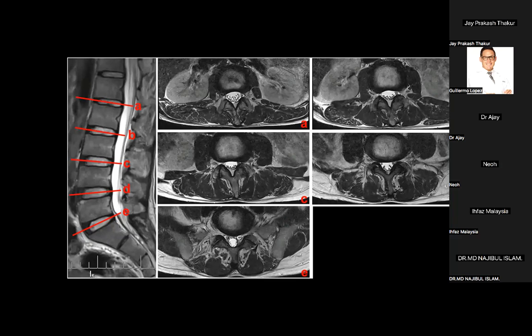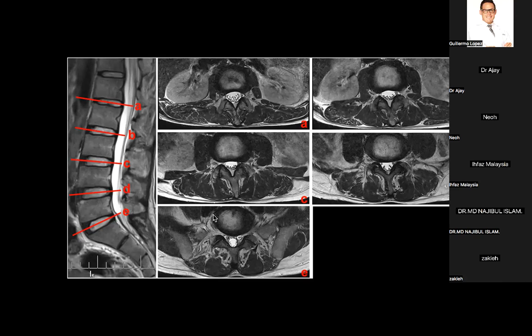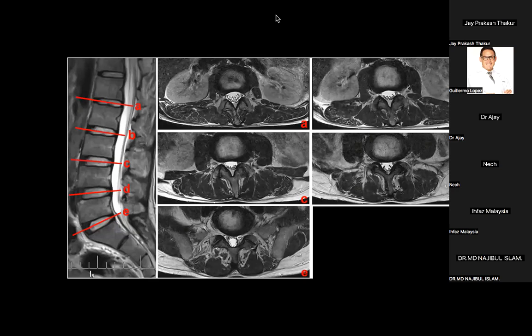This is the same on MRI also, you can see. On MRI also you can make it out. Look at here. See the facet joint here. Look at the facet joints here. Can you see them in relation to the disc? Look at this. Understood now? Very clear? Clear?